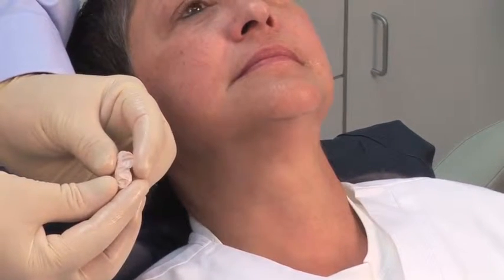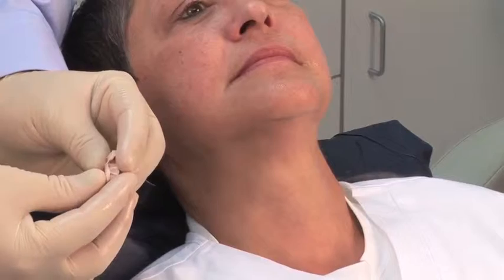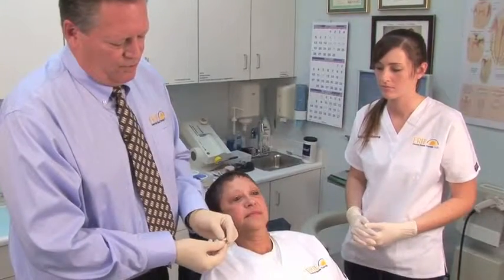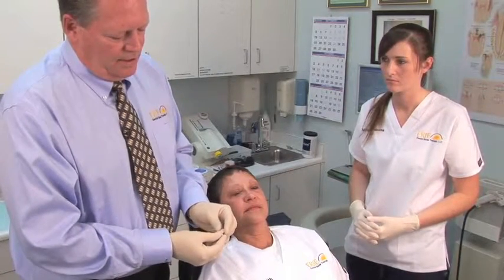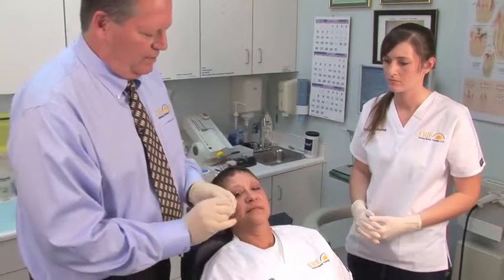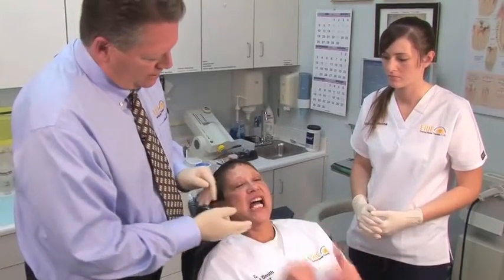We'll take this to the sink and put it in some ice water to verify that it is nice and hard and set up. After adequate time in some ice water to verify that this is solid and completely set, we will deliver this to the patient. Debbie, I'll let you try and place this over your lower front teeth. And close.